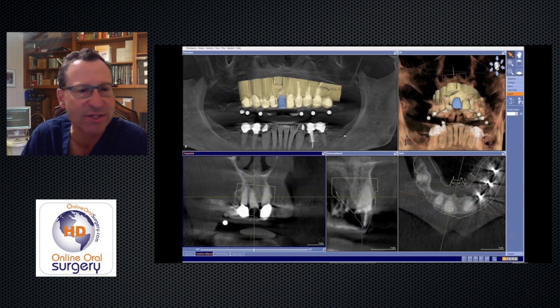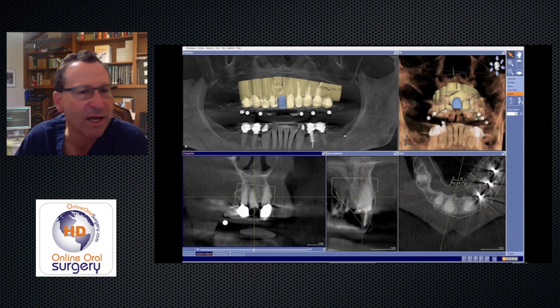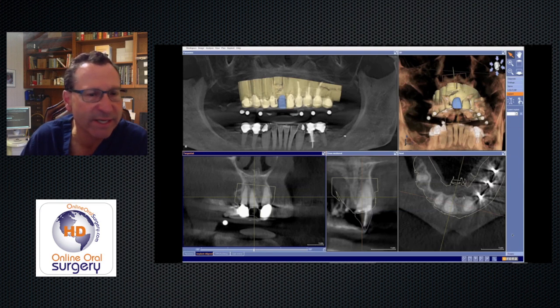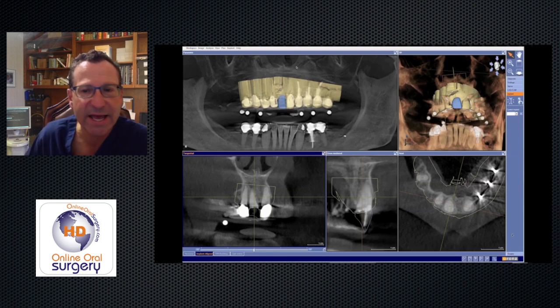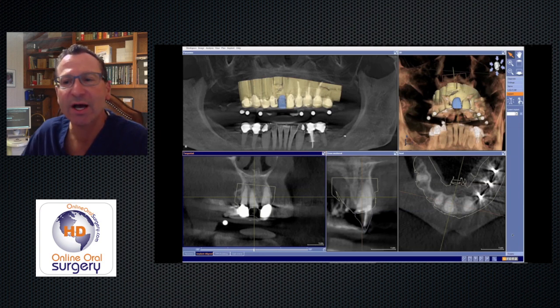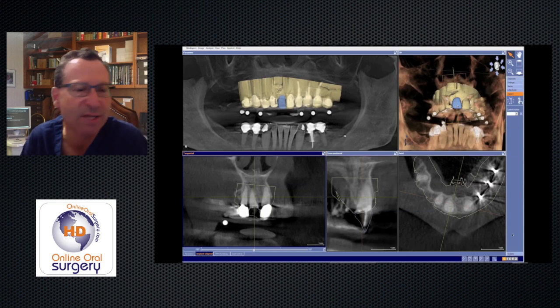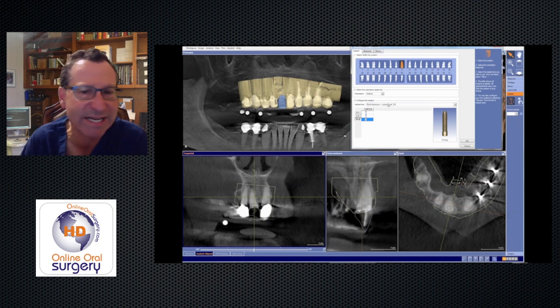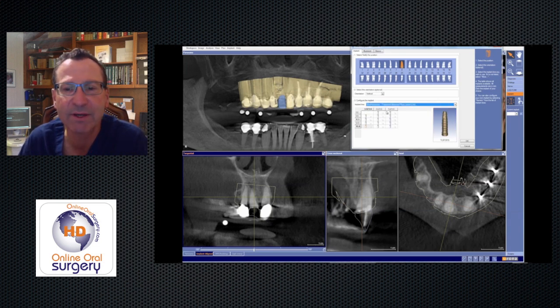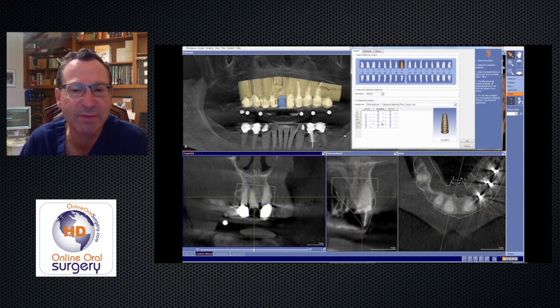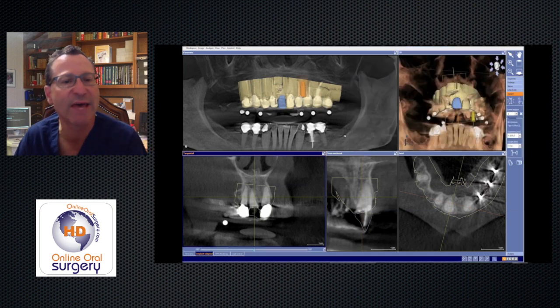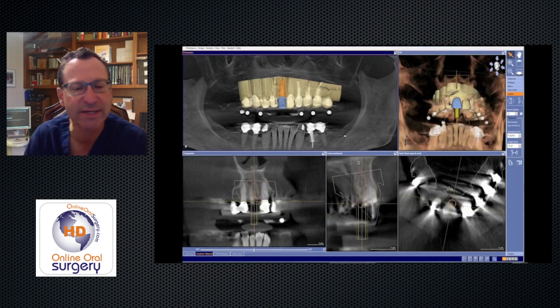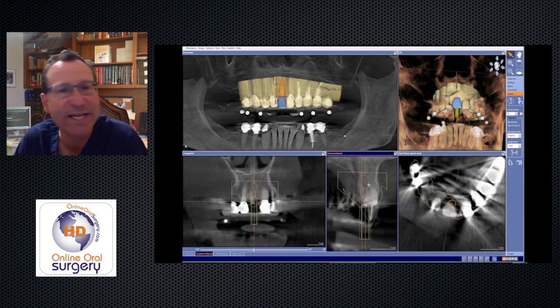This is the system I have in my office — the Sirona Galileo — and I also have a Sirona CAD/CAM system. I'm able to import my 3D optical scan of the patient's occlusion into my cone beam scan, along with my proposed restoration — a digital pontic made in Sirona — and import all this data into the scan for implant planning. I select my implant system: at site number 8, a Bio-Horizons tapered internal plus laser lock, 4.6-millimeter diameter, 12-millimeter length.